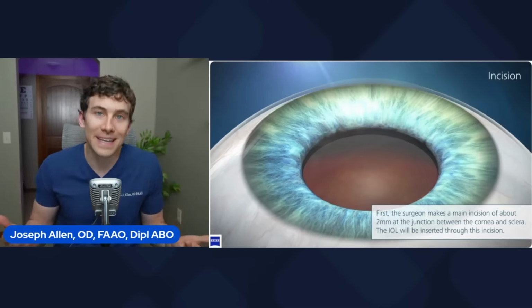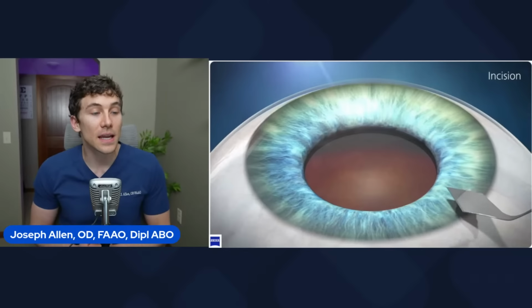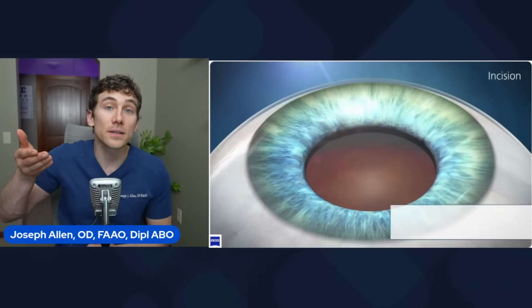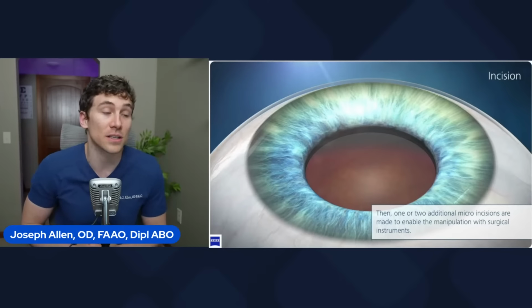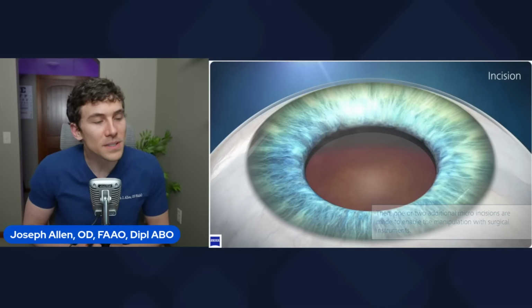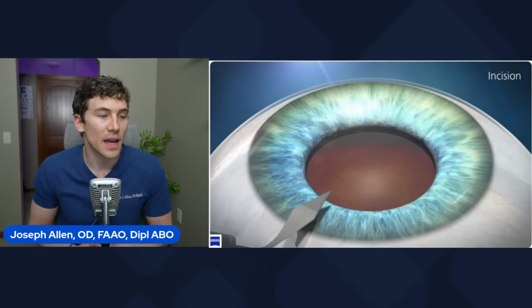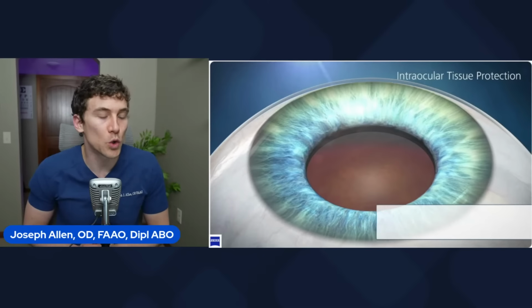showing how at the beginning of a surgery, they do numb the eye so you don't feel anything. And then a type of blade is used to cut a 2 mm incision on the surface of the eye. There's usually 2 incisions that are made, sometimes 3, but usually 2. And this type of scalpel is used to create a very tiny open wound on the eye.